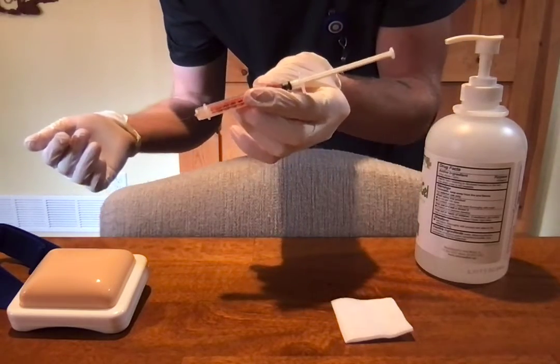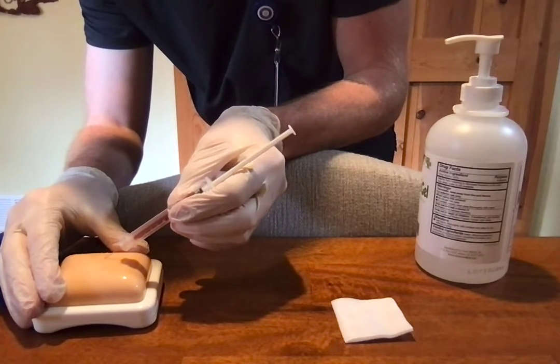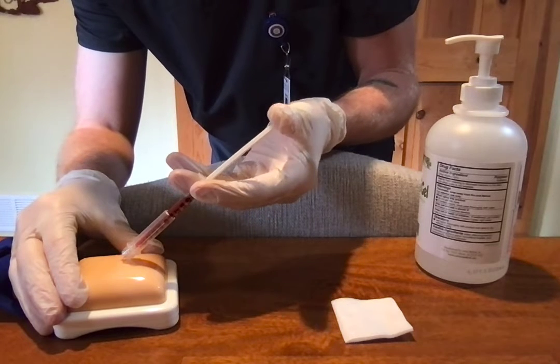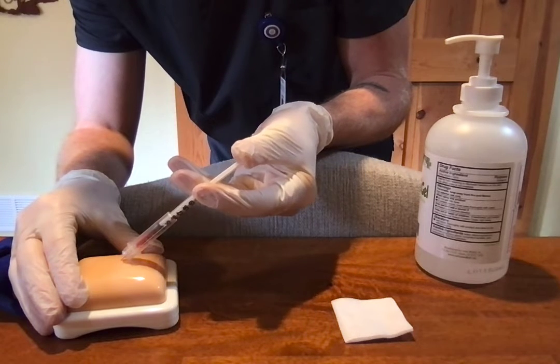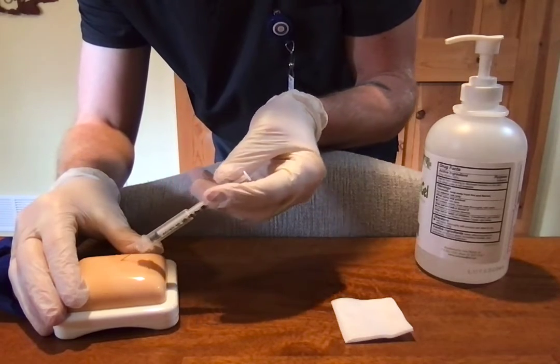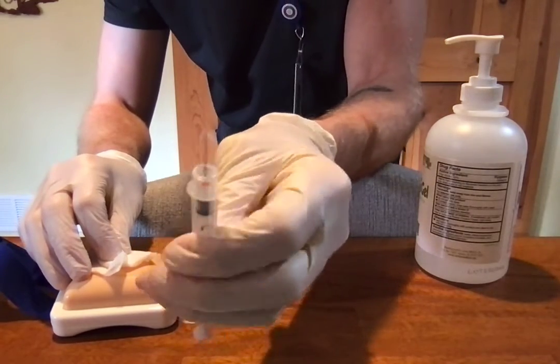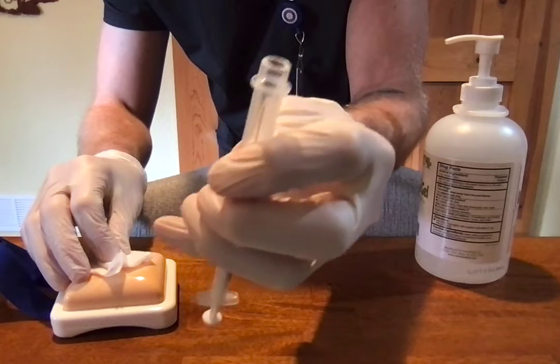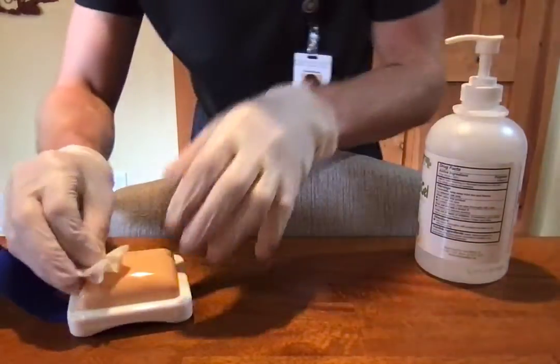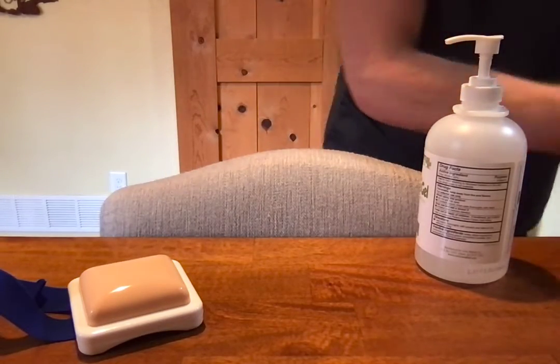It's going to go at a 45-degree angle into their skin. So you're going to feel a slight bee sting here with this heparin. And then you would administer at that 45-degree angle. And pull out, and then if we have any blood, we want to go ahead and cap until we hear the click right there, and then we would dispose of this in a sharps container and use a little bit of that gauze on the patient.